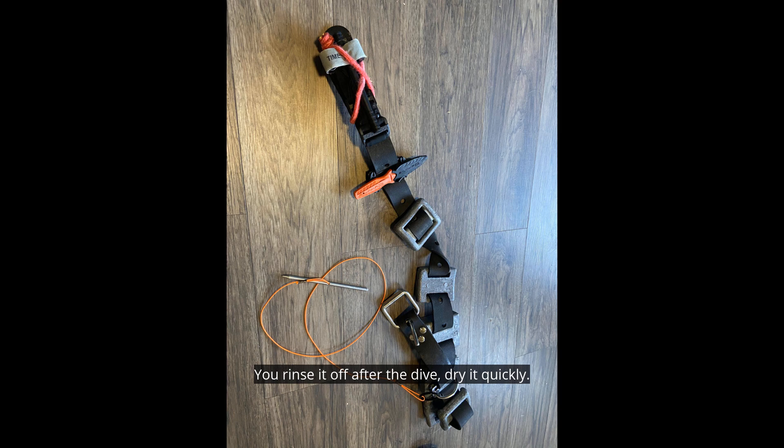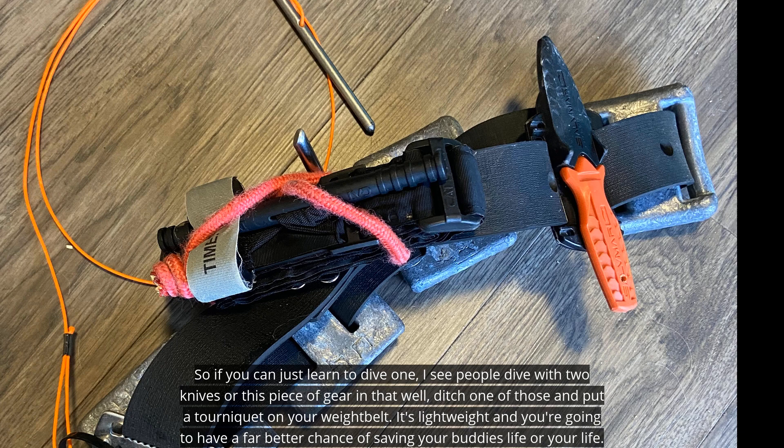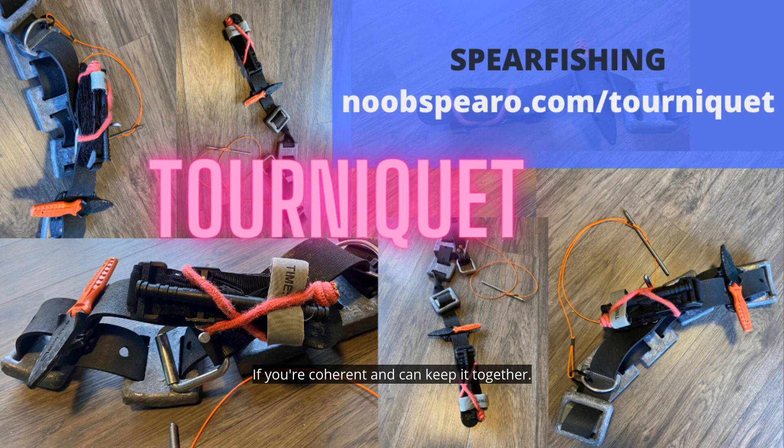You rinse it off after the dive, dry it quickly, keep it out of the sun, and it lasts a long time. If you can just learn to dive with one — I see people dive with two knives or extra pieces of gear — ditch one of those and put the tourniquet on your belt. It's lightweight, and you're going to have a far better chance of saving your buddy's life or your own, if you're coherent and can keep it together enough.